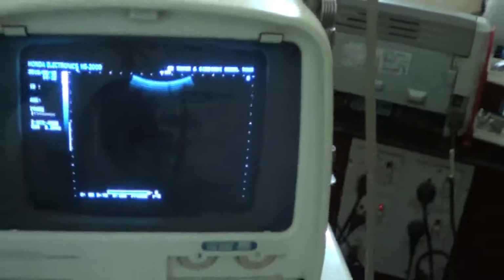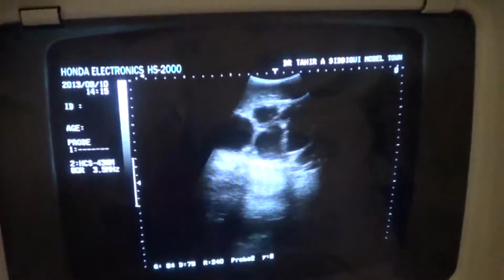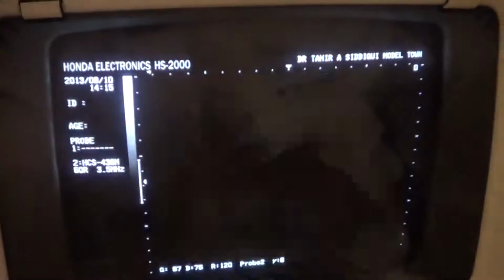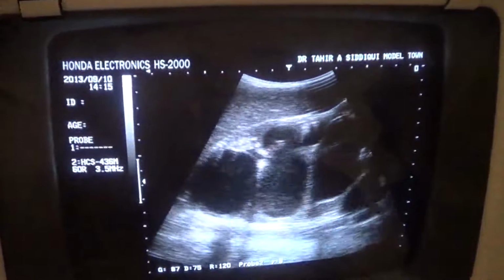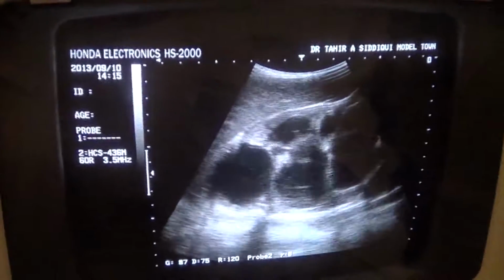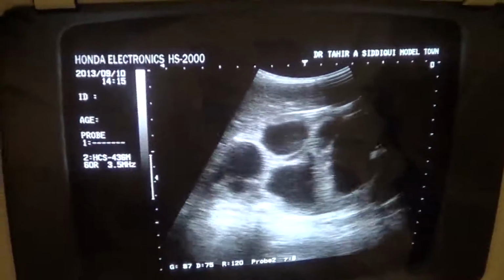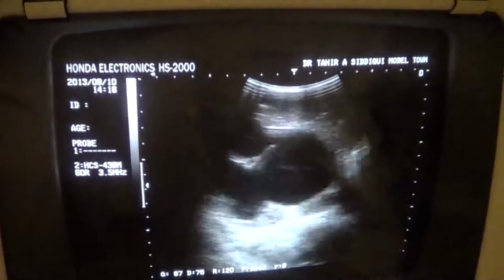His growth is not as compromised as one would expect with this sort of situation. Now the ultrasound shows bilateral hydronephrosis. The kidney is significantly dilated. All the calyces are dilated, minimal to rather massively, with thinning of the parenchyma in this location.